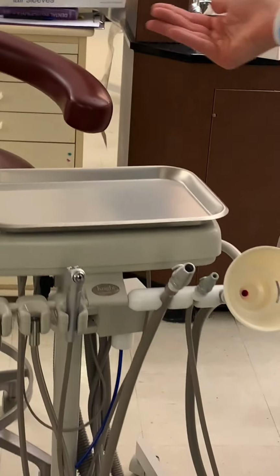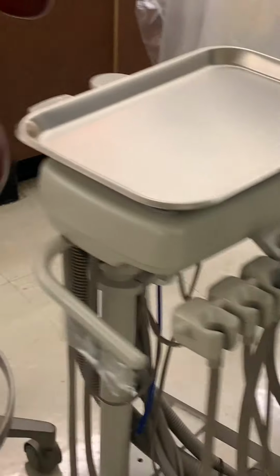If the unit is already on and you're leaving it on, you don't have to worry about barriering the on-off switch.